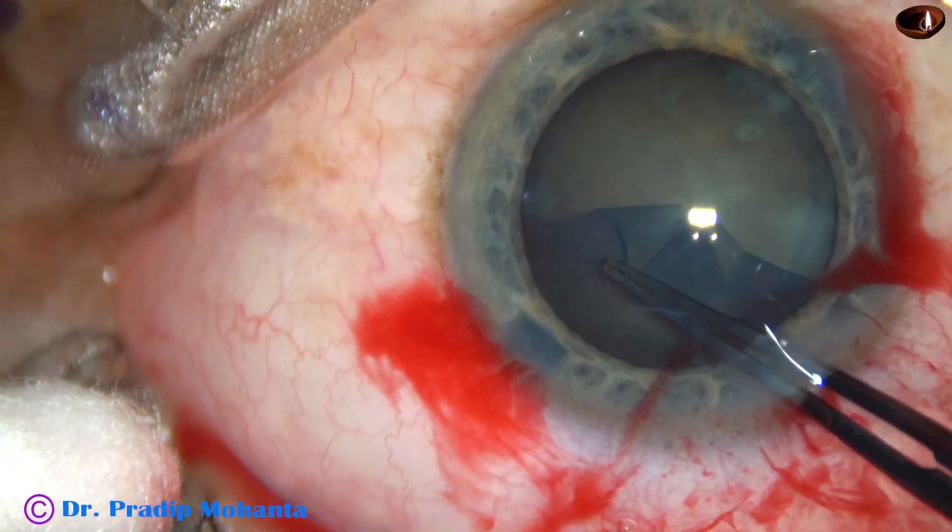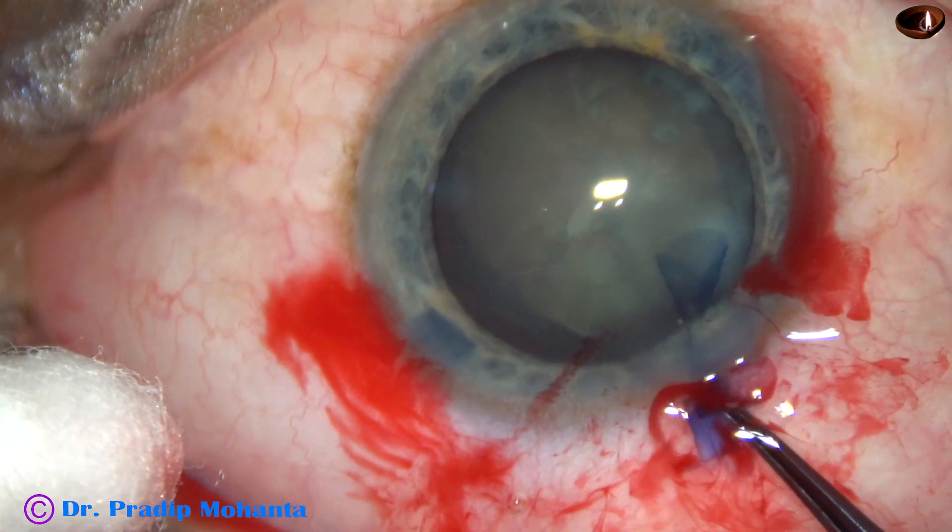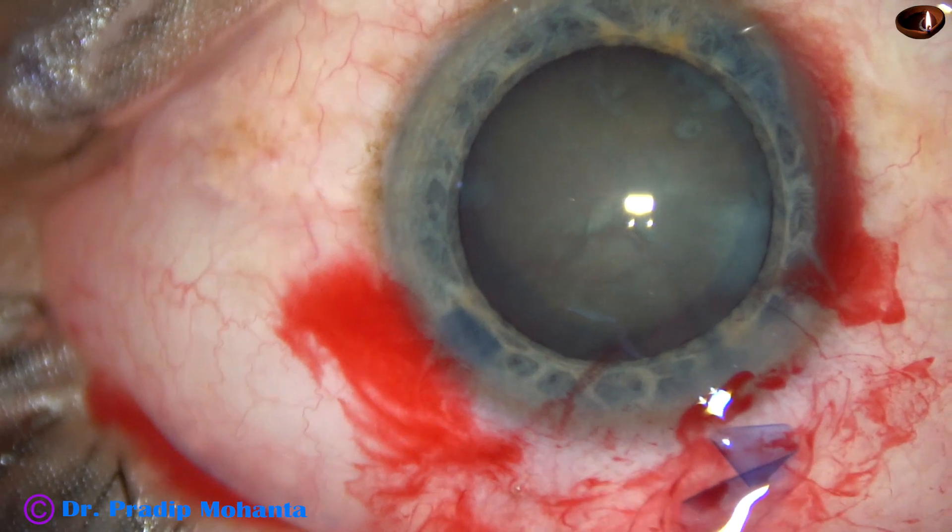So, I hold the capsular tag and make some jerky pulls — 1, 2, 3, 4, 5, 6 — in this way, and the capsule has been brought back to the track.